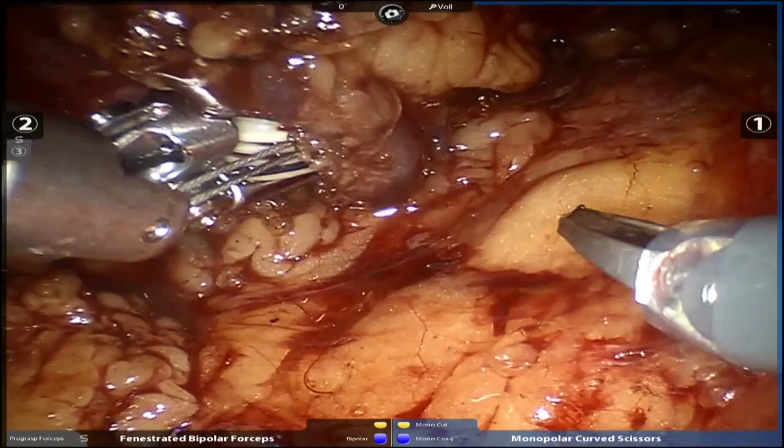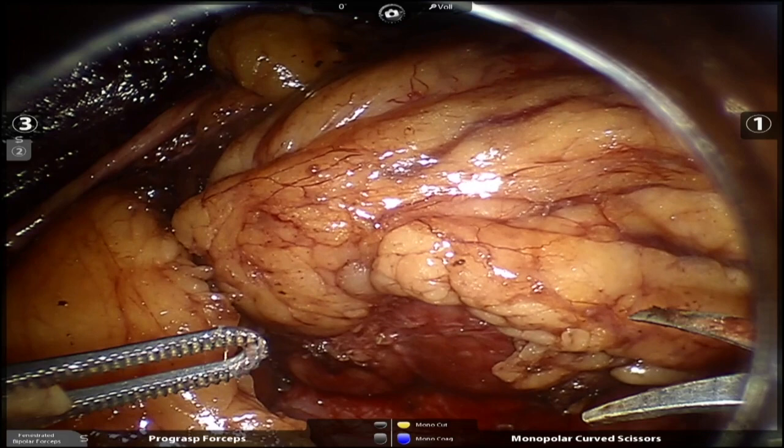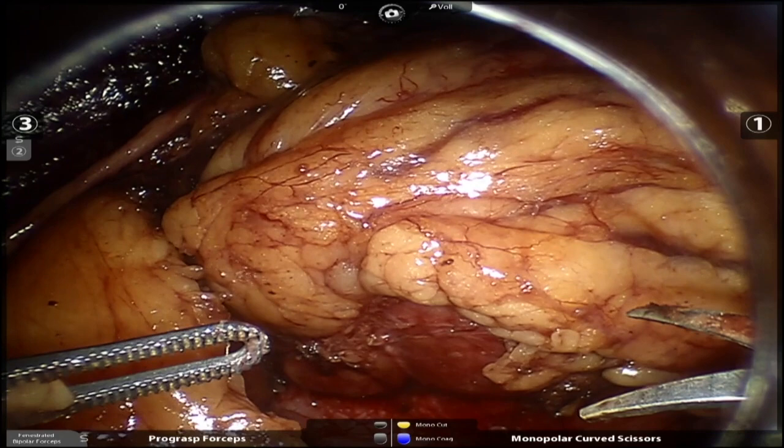Okay, so we may switch the Prograsp and the fenestrated, because I really need to push the kidney away, and that's going to be done better with the Prograsp. So let me do the ultrasound with this, and then we'll probably switch those two instruments. It's a very important technical point. Yeah, right here. Yeah, it's fine.